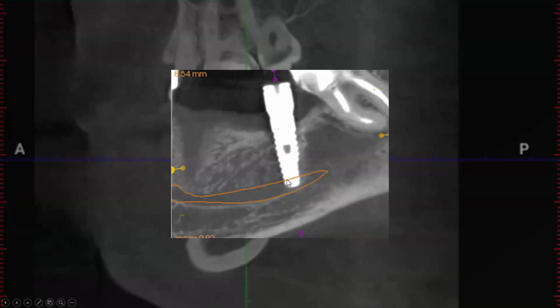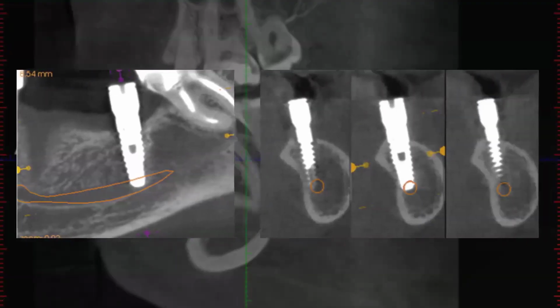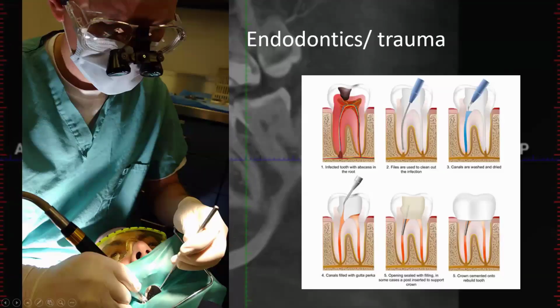And so all these things are important with implant planning, because obviously you want to avoid the canal, right? There's neural, but there's also vascular structures in there. It could cause damage to the nerve, cause pain and paresthesia of the mental nerve. Not a good thing for the patient. All right, another one showing once we've traced this nerve with cross-sectional images, we see that it's gone more than halfway through the canal here. And so this was causing the patient's symptoms. Not a good scenario.